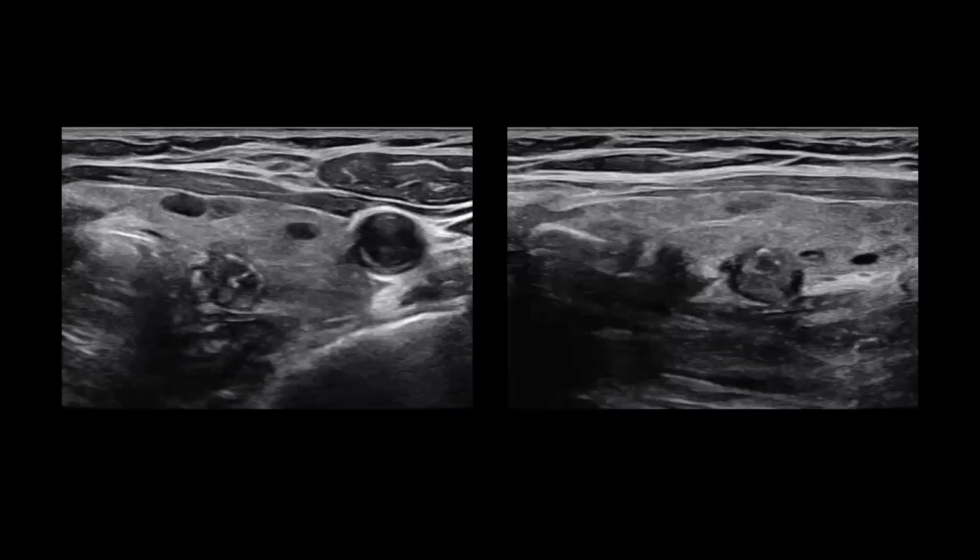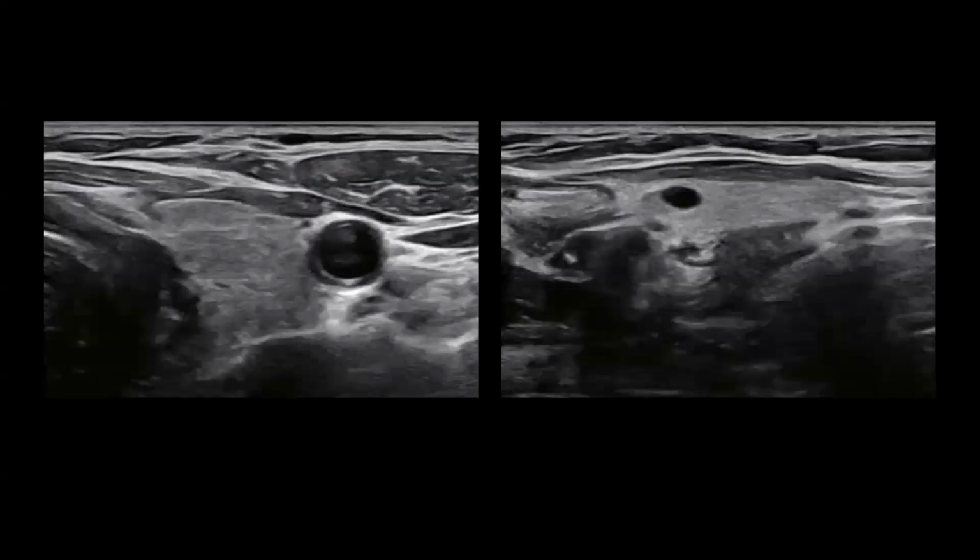And here's our sixth case. This patient was referred for evaluation of a suspected thyroid cancer. Given the lesion's location, connection to the esophagus must be carefully checked on ultrasound. Ultimately, no esophageal connection is observed, and the lesion is confirmed to be a thyroid lesion.